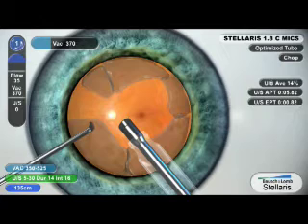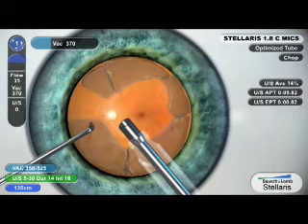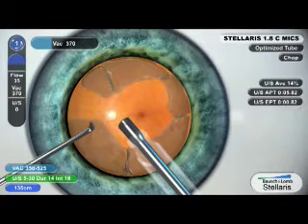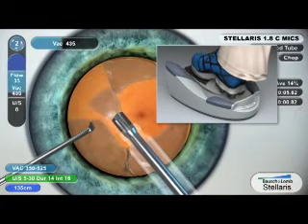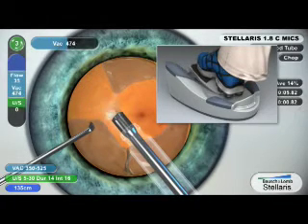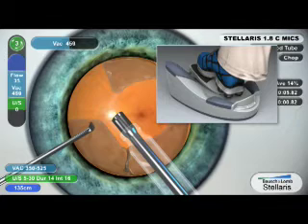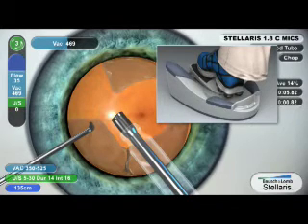Unique to the Stellaris system is the intuitive surge and control of both power and flow provided by the pitch and yaw of the dual-linear foot pedal controller. The ability to independently modulate power and flow facilitates on-the-fly control of the procedure.